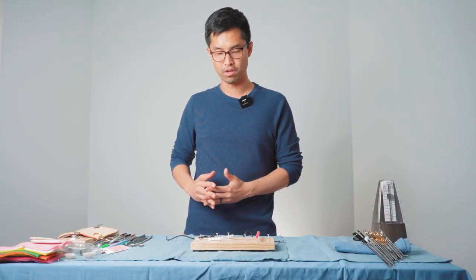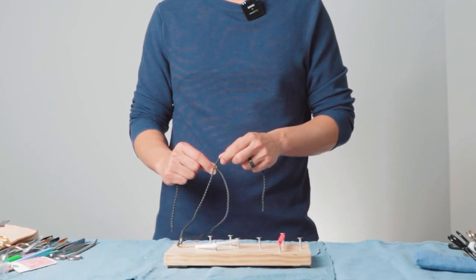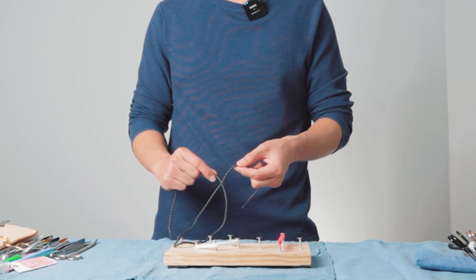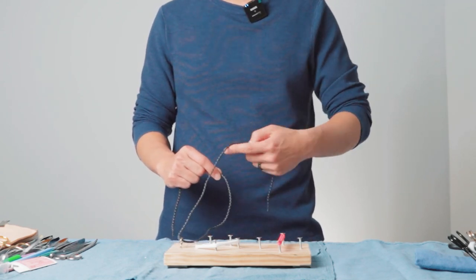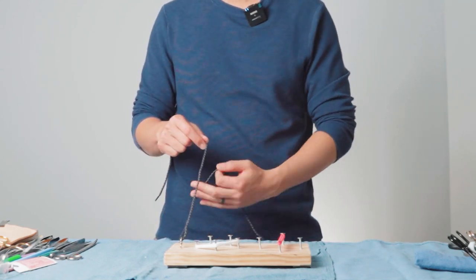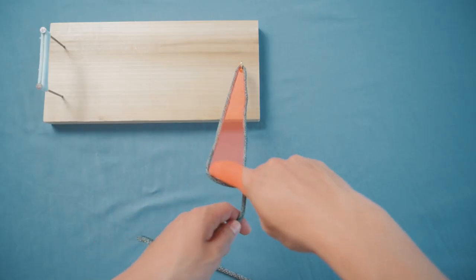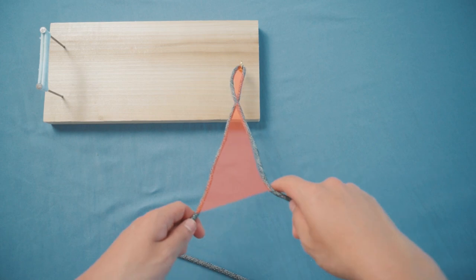One last nuance before the end of this video: when you're first starting out your knot, you want to have your threads be crossed. Whichever hand you're tying with, if that thread is at the top, then you want to start with the forehand to create the loop. If that thread is on the bottom, then you want to come in with a backhand to create the loop. This is because when you move your hand across to create the loop, this ends up uncrossing the suture.